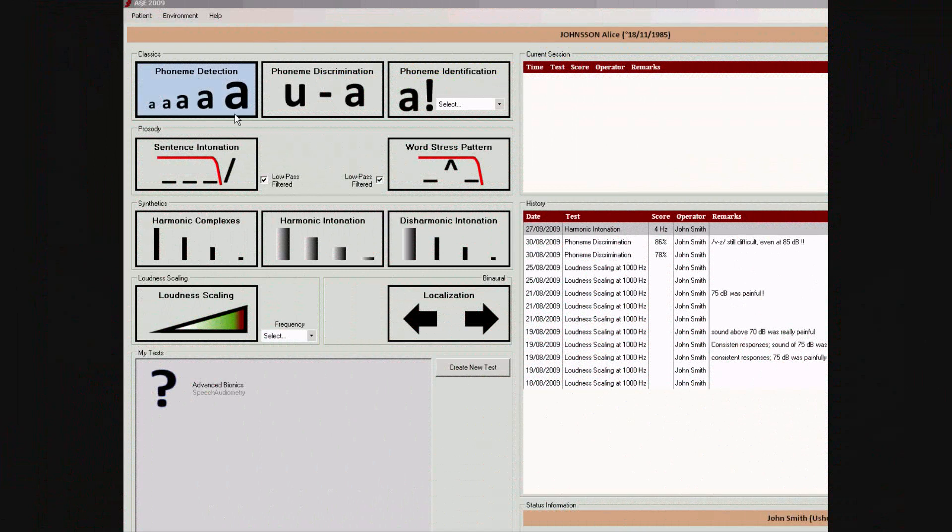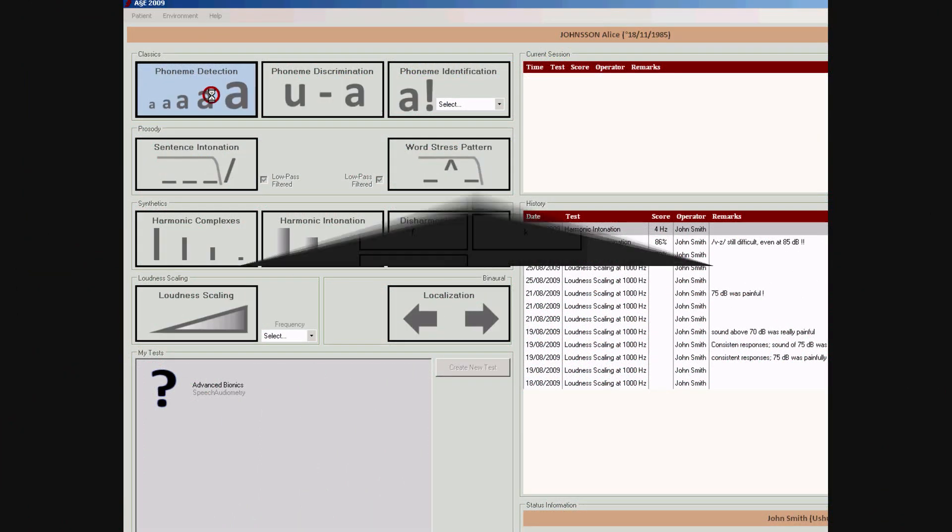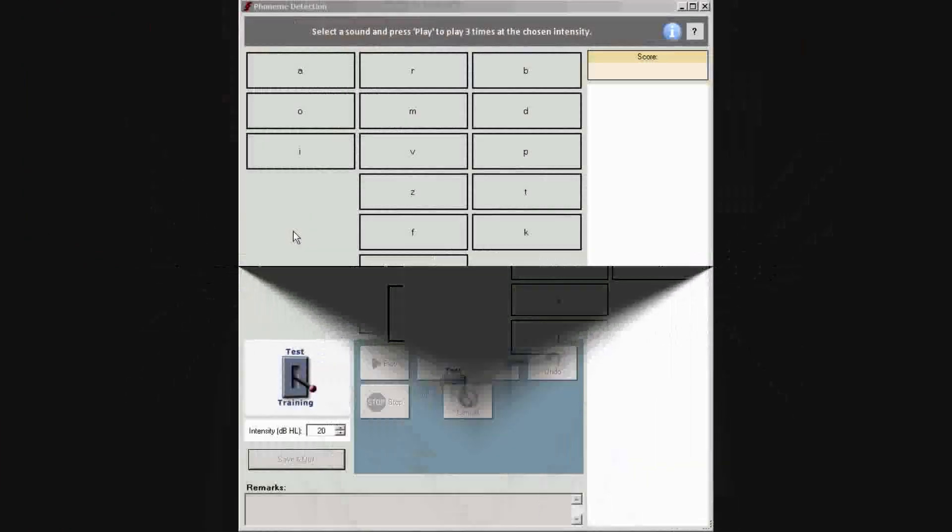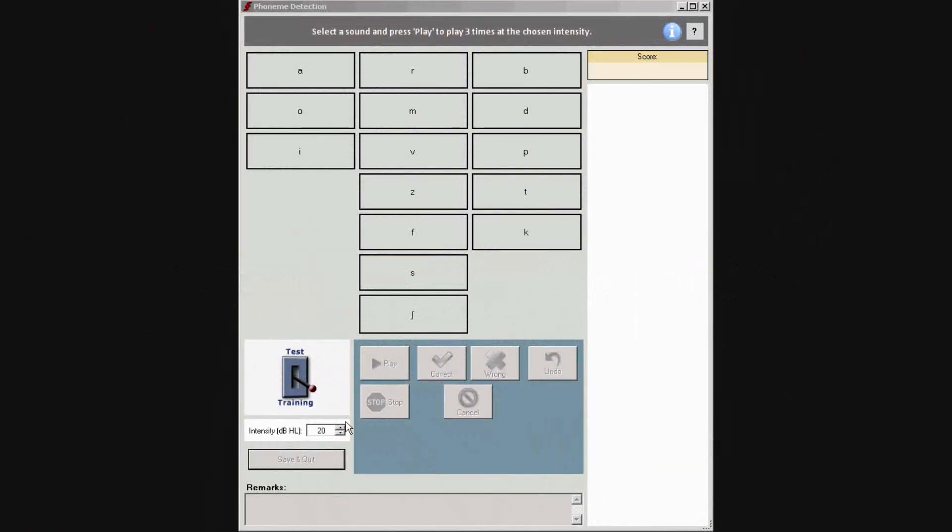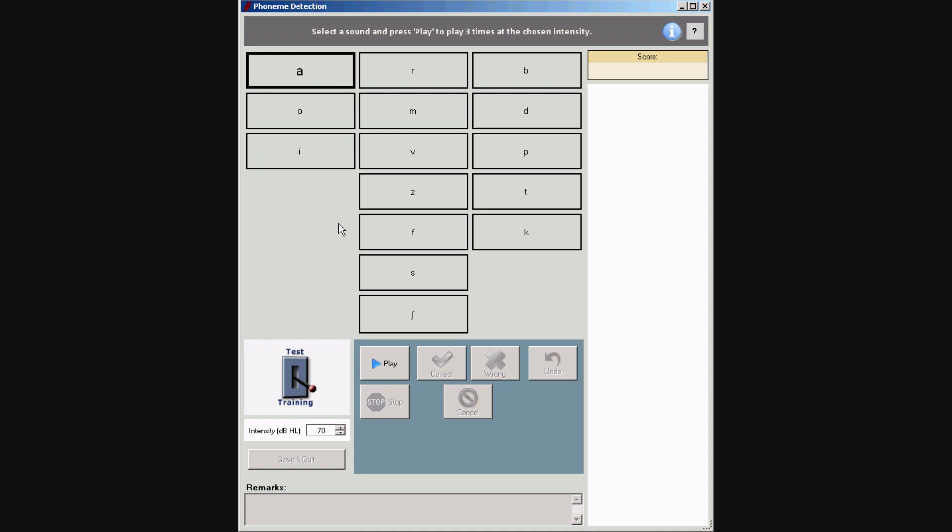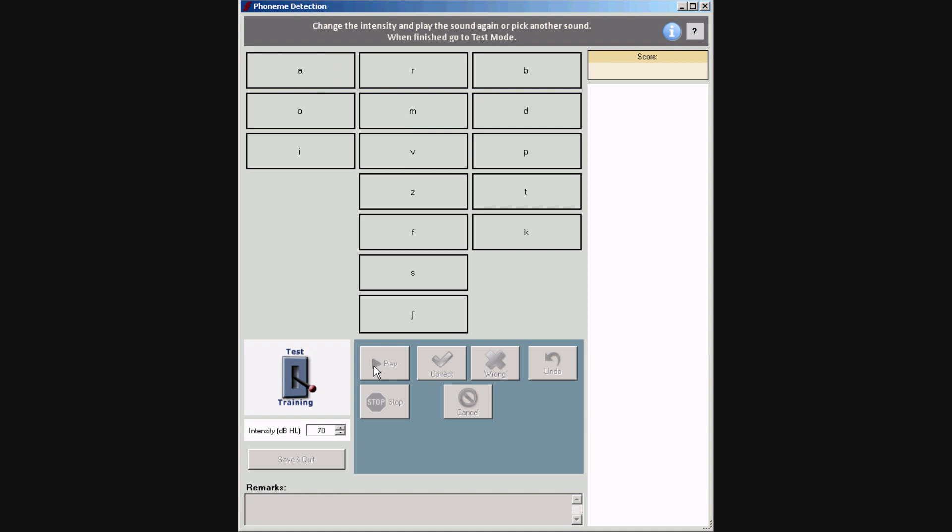Click on the Phoneme Detection button to open the test. The test window opens in training mode. Select a presentation level and a sound, and press play to present the sound. Instruct the listener to respond when he or she hears the sound.